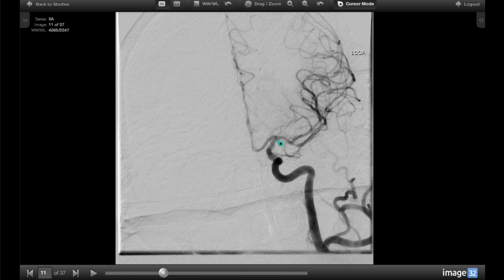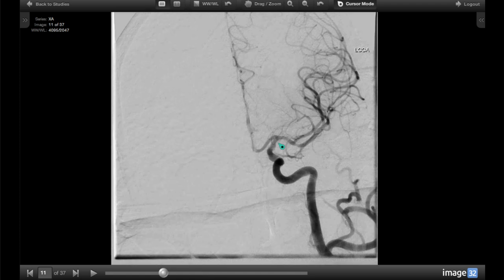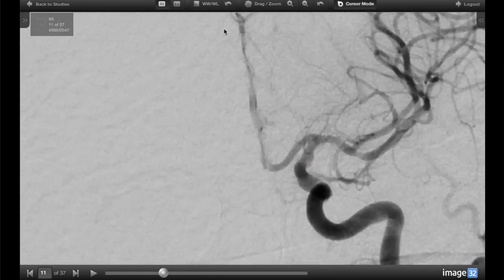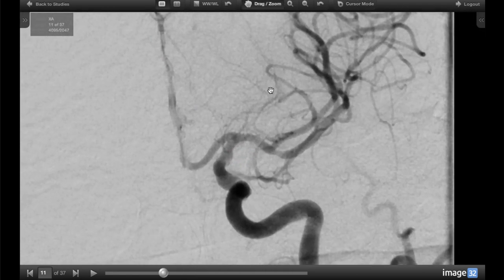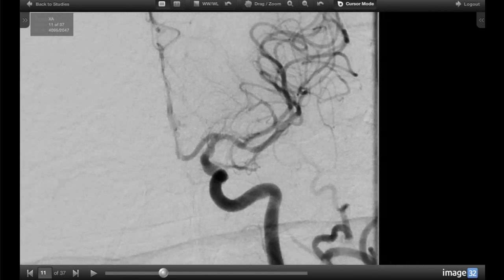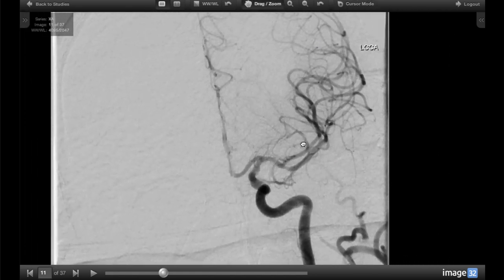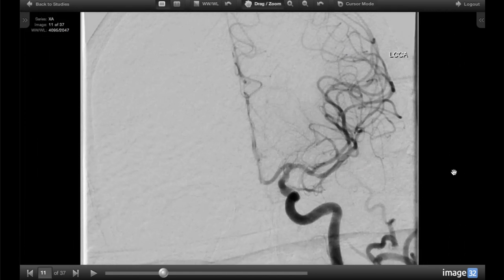If we zoom in, we see the top of the carotid, this T-configuration, and we see that the blood flow is normal because the clot has been pulled out from that location where it had blocked the top of the carotid.